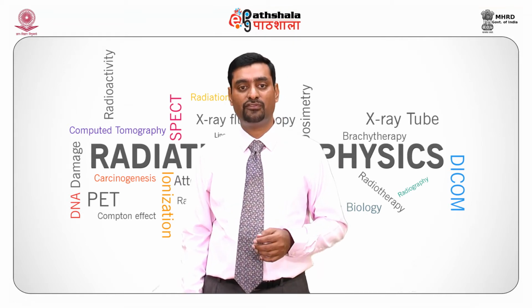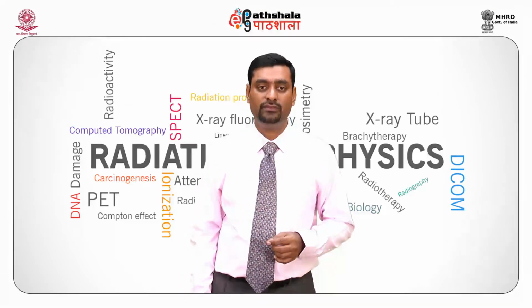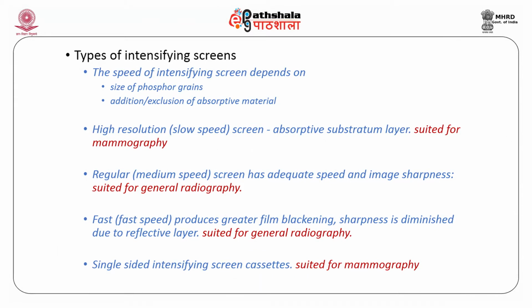What are the various types of intensifying screen? The speed of an intensifying screen depends on the size of the phosphor grain and the addition or exclusion of absorptive material. High resolution, that means slow speed, intensifying screens can be used for mammography. This usually has an absorptive substratum.